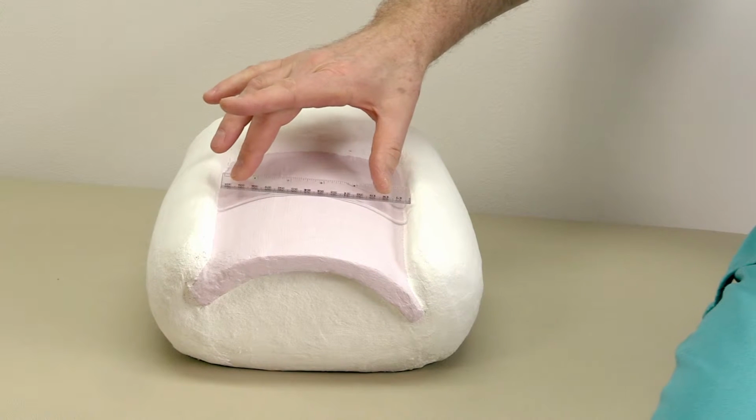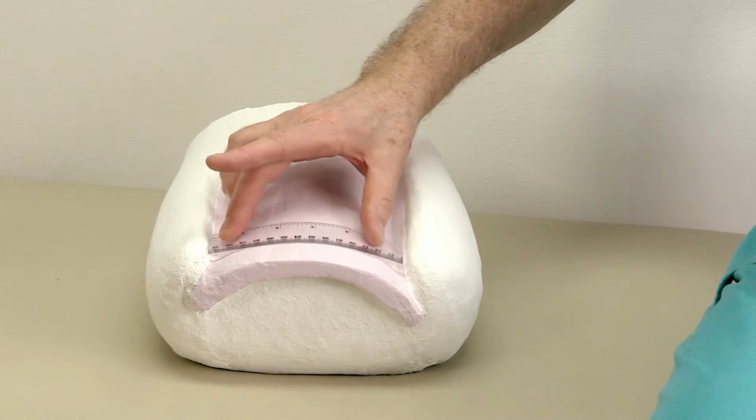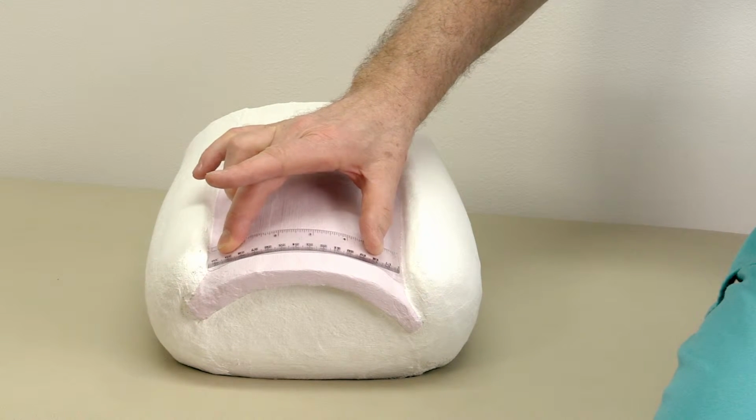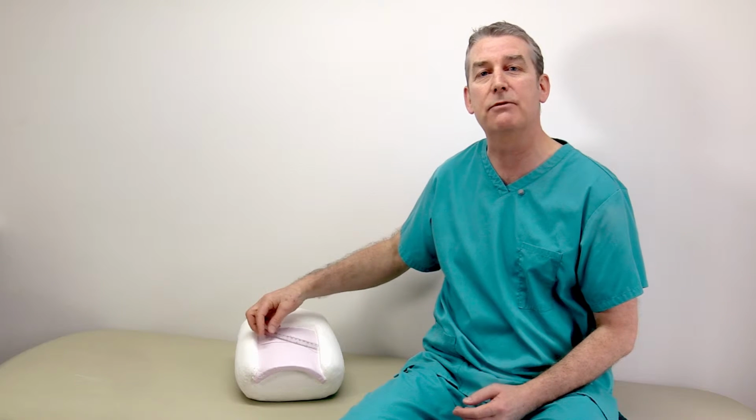Applying it further up the nail towards the free end gives the maximum pull, but applying it about halfway down gives a longer lasting treatment. One brace application might be all that is required to get you over that problem. However, multiple applications may also be necessary to ensure that you remain pain-free.